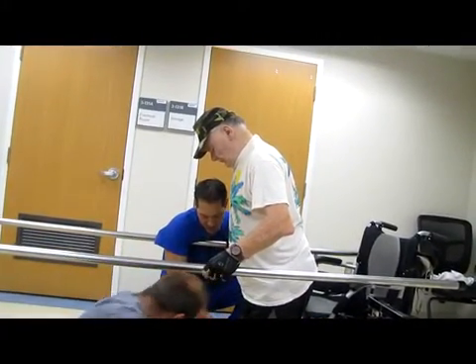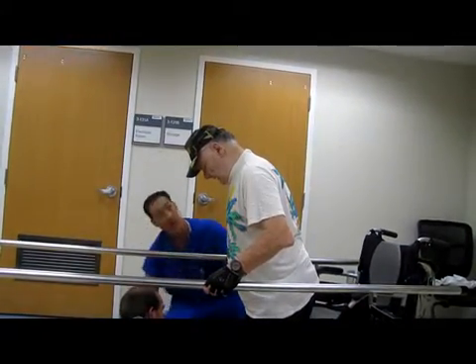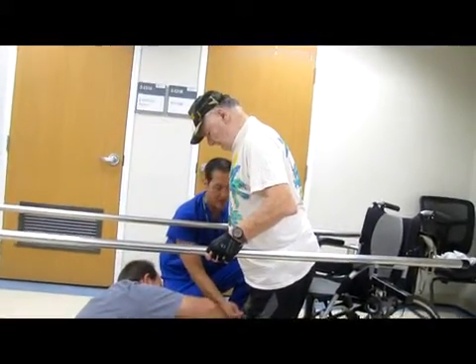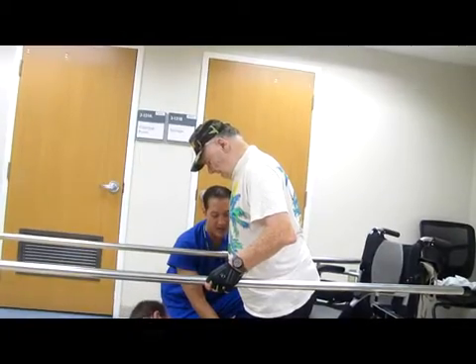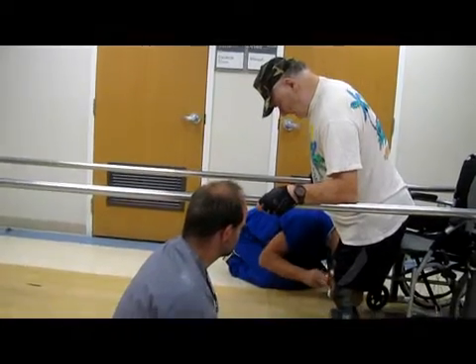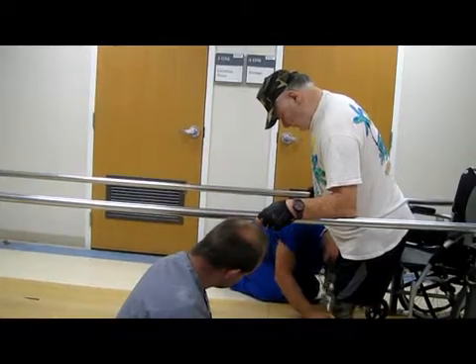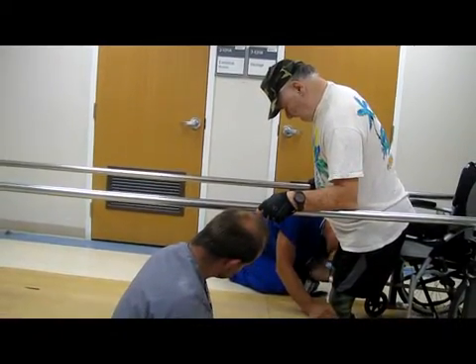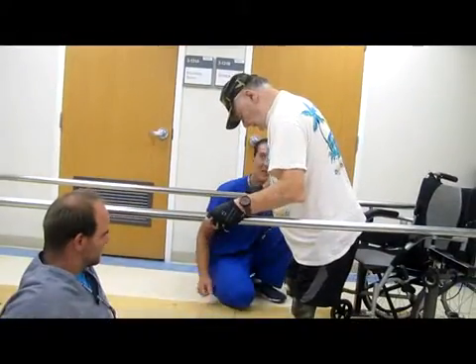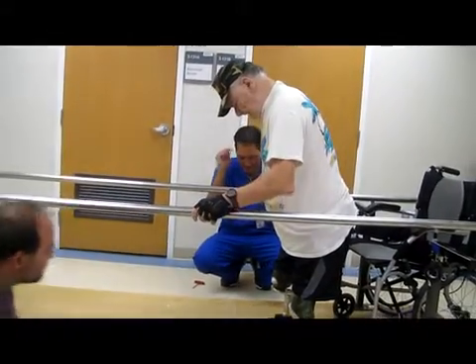So I want to just make sure we're down. First of all, it feels like I'm on a heel on the right one a little bit. Yeah, on this side you're not down all the way. Can you press your weight down on the right side further? How's the comfort? Okay. Let's see if this will help us with that. That insert should be able to be transferred from shoe to shoe. Just go ahead and take some steps, Ron, and we'll dial it in further.